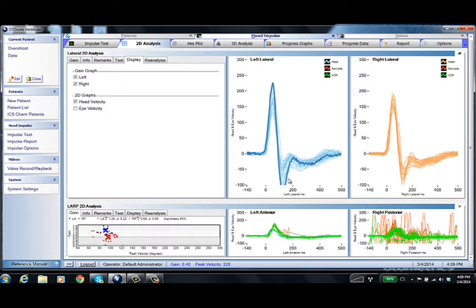So how would you know if this person has unilateral loss? But the other issue is that if the eye is moving with the head, you've moved the eye away from the fixation dot, but then you move the eye right back to the fixation dot. So you're not going to see this person have a catch-up saccade anyways. So there's a lot of issues, and again, this is documented in the document that goes along with this video, but overshoot is not optimal for being able to diagnose a VOR disorder.